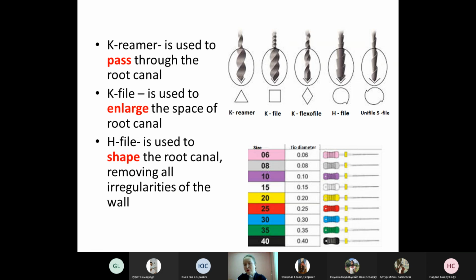And one more important piece of information about endodontic instruments is their taper. Taper increases by 0.02 millimeters for every millimeter the instrument gains in length. So that is the taper of the instrument, 0.02. It is the typical common taper of instruments.